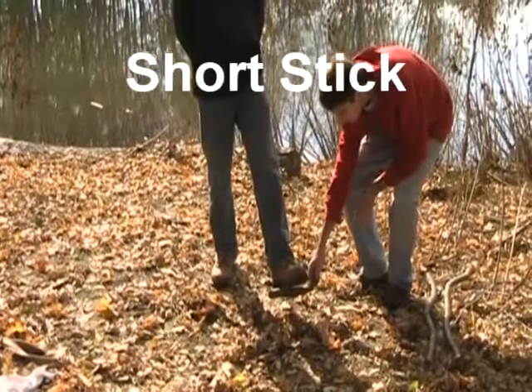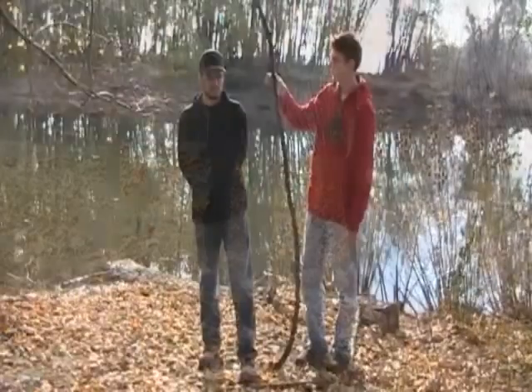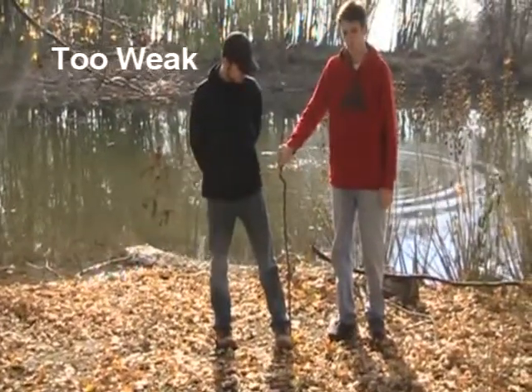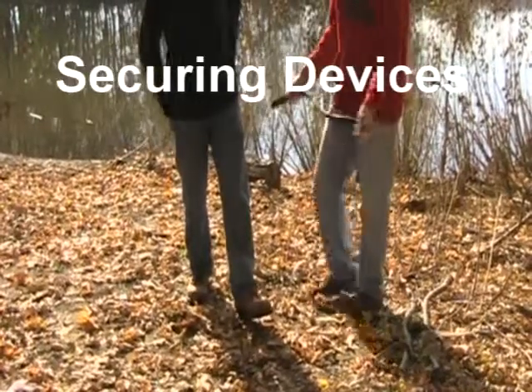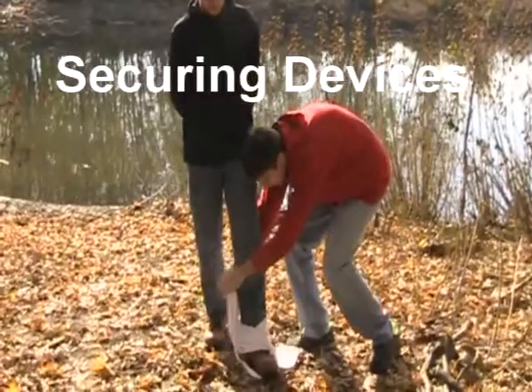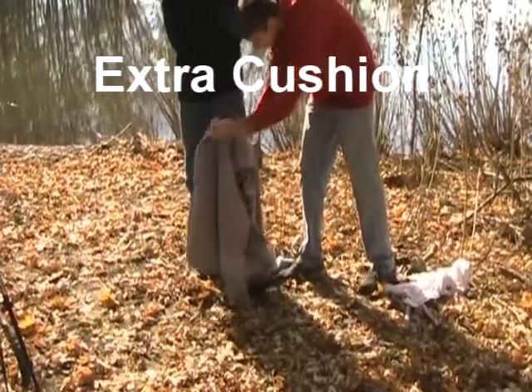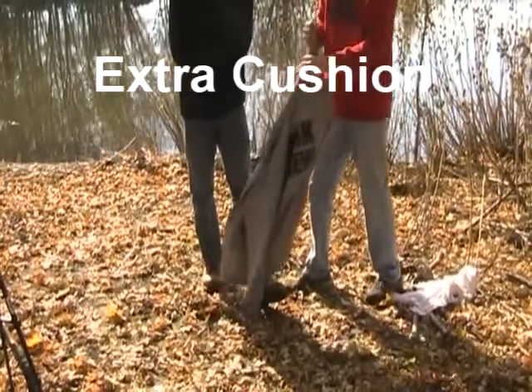The third and final stick needed should be approximately 1 foot long. The stick should be straight, sturdy, and non-jagged. This stick is too tall, but this one is too flimsy. We are using 2 belts and a t-shirt as our securing devices for this splint. The sweatshirt is used to provide cushion around the leg, in between the sticks, to prevent abrasions from the splint. If there is nothing available to fulfill such a task, this material is not required.